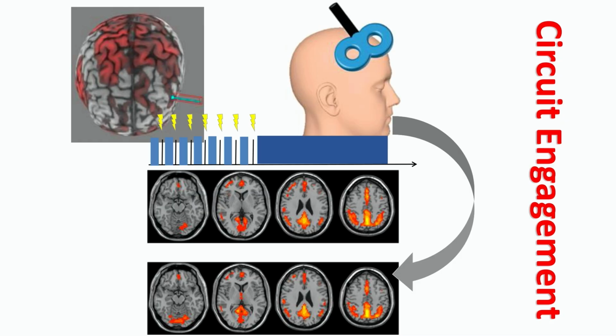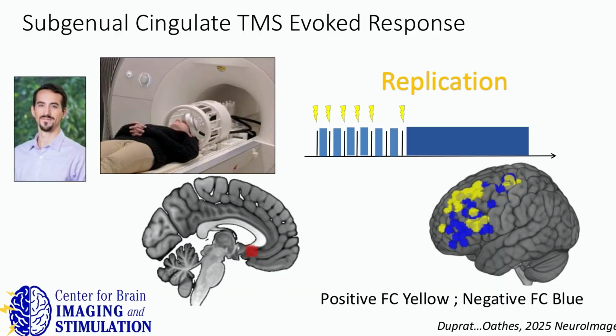In terms of methods, there's one paper out there that helps with deciding this, which is Colin Hawco's paper suggesting you need at least 50 pings to get a good, reliable brain-evoked response. So we do 71, so we're over the 50, which is good. You get a whole brain readout for the price of that one acquisition.